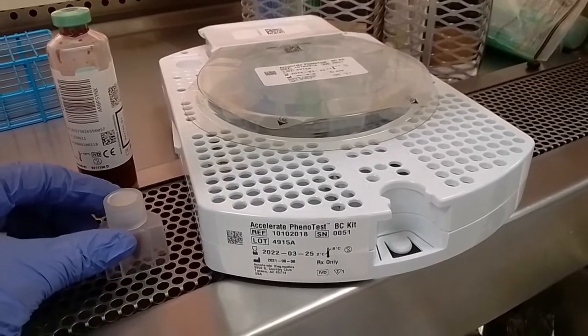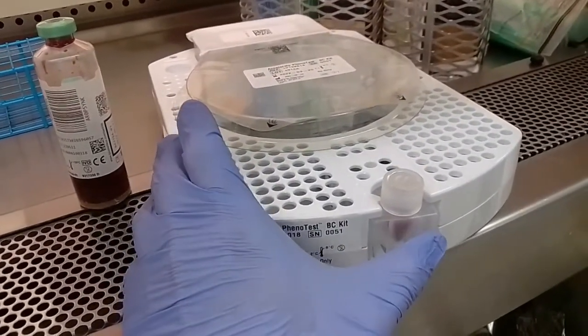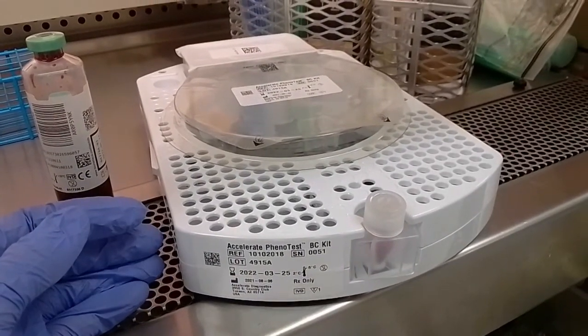And then normally another thing we have is potentially an ID and AST system. So you can get an ID of the organism within 2 hours. You can use something called the Accelerate, which you can see here. And that'll also give an antimicrobial sensitivity or susceptibility for the organism within like six hours after the ID. And then the treatment can be specialized for what the bug is susceptible to.